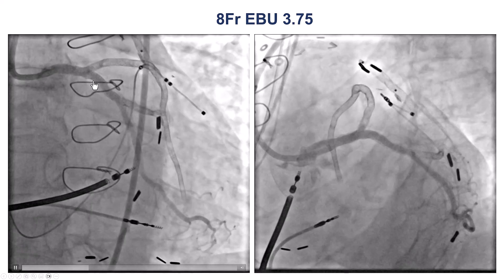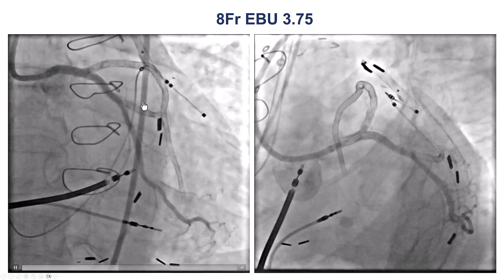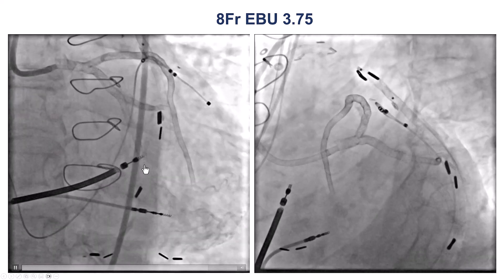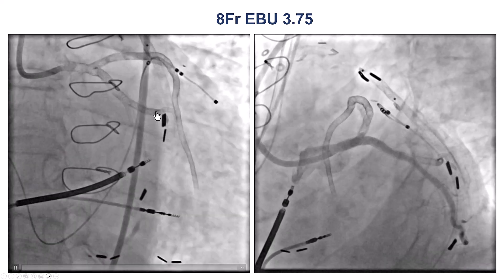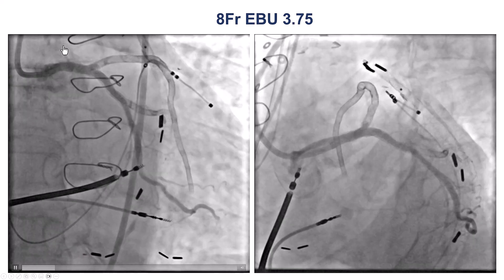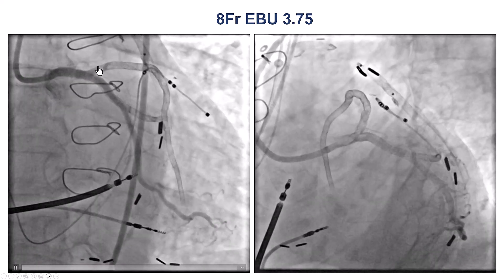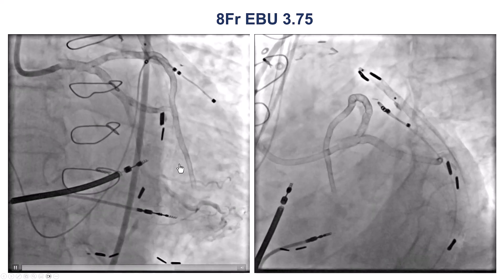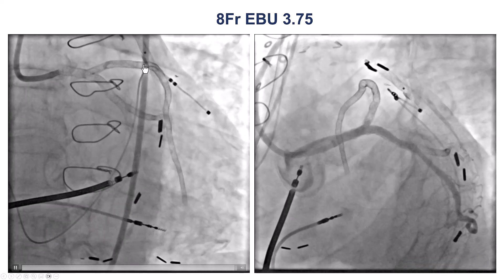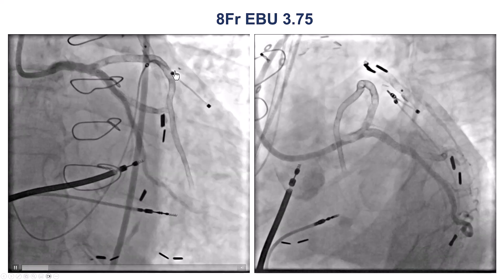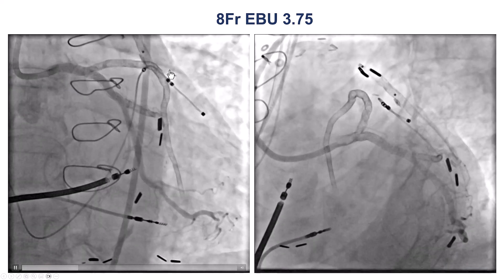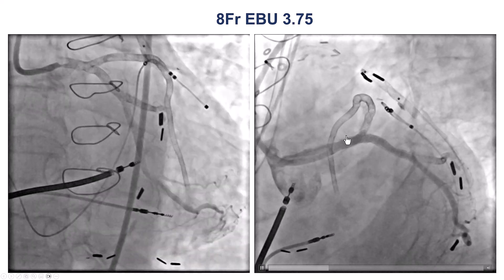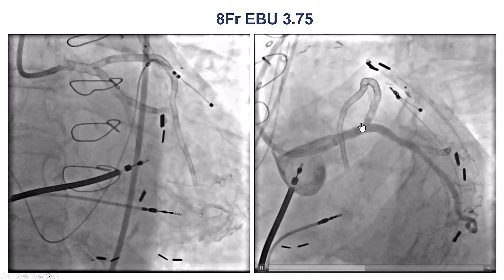These are his arteries. You can see there is a full metal jacket into the LAD, full metal jacket into the circumflex and obtuse marginal branch. This is extensive stenting, and the LAD is completely occluded. This was considered to be the culprit vessel for the patient's symptoms.